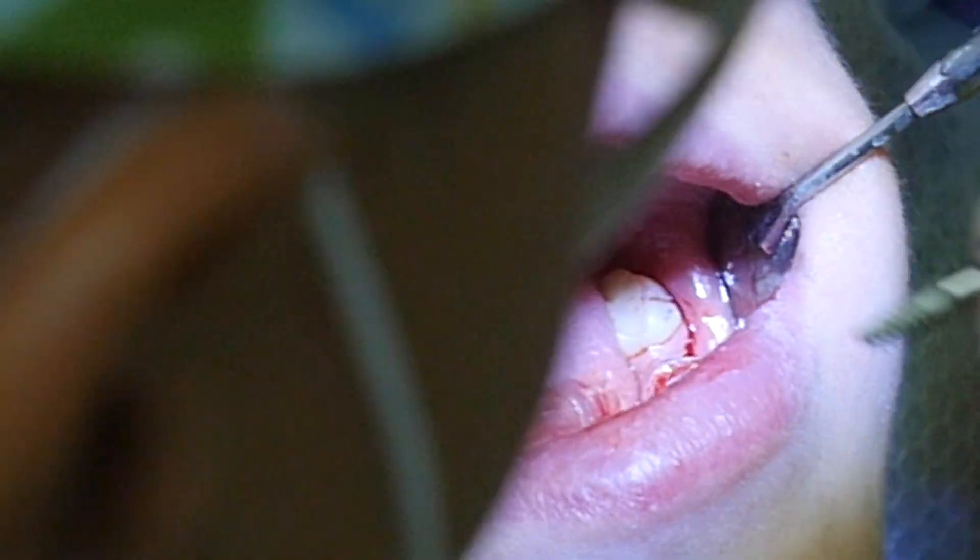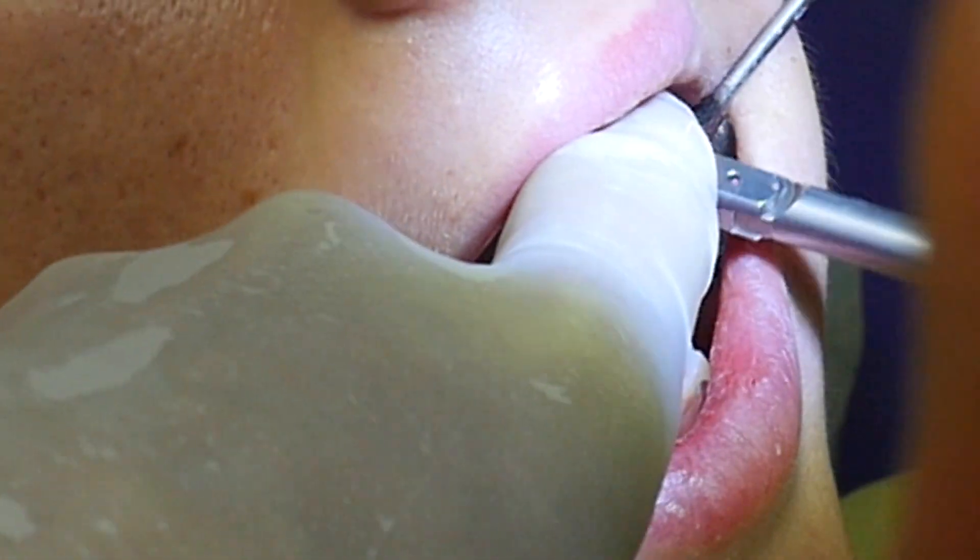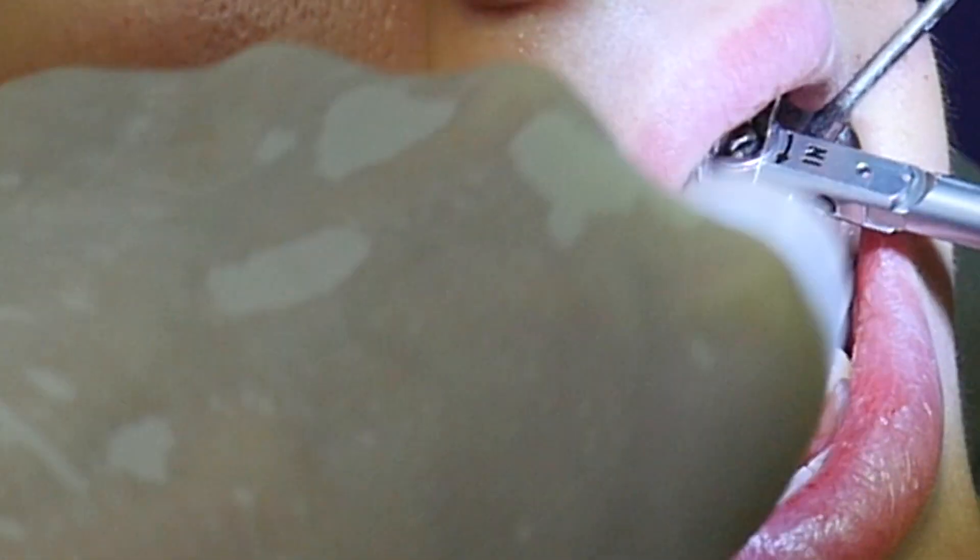The DSi Premium Line Implant self-taping feature allows comfortable placement and high initial stability, even in deep sockets or 3D defects.